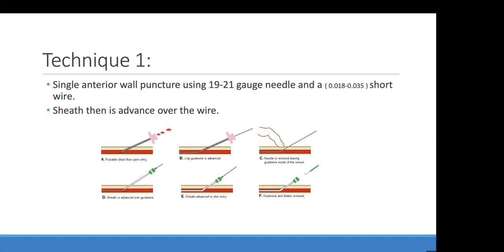Number two, injection of nitrate, NTG, nitroglycerin, subcutaneous. Make sure that you're not in the vein or the artery, but it doesn't matter. Even if it hit it, it will not matter. If the patient is spastic, give subcutaneous. I'm not sure it does work, but I do it, and it worked. I don't know if I got it by chance or luck, or it was that the nitrate diffuses into the arterial wall and prevents the spasm. This is not routine, it's only when you have difficulties or when you fail.